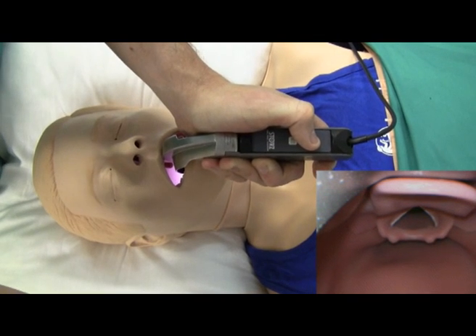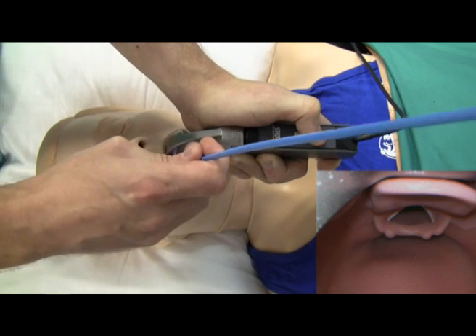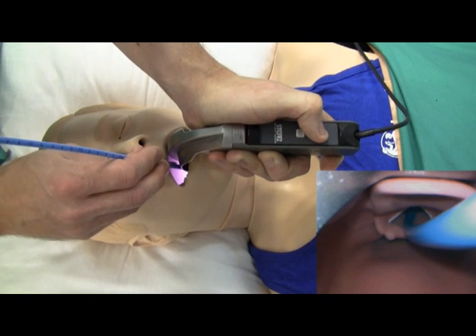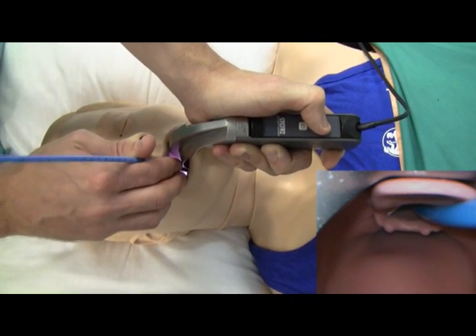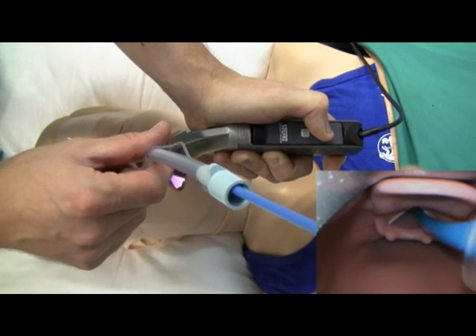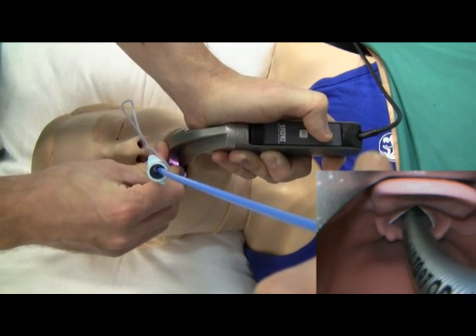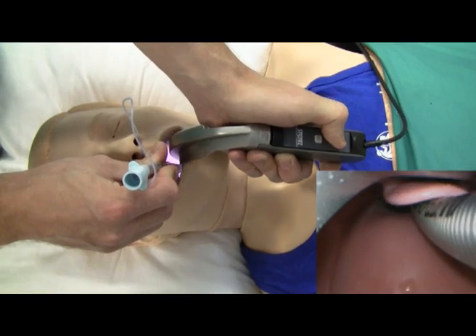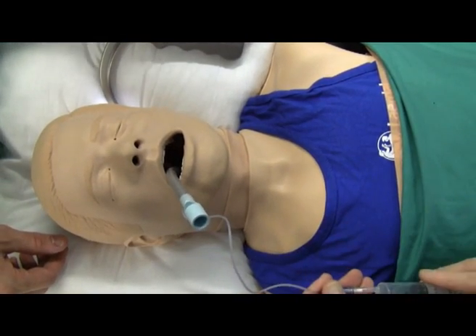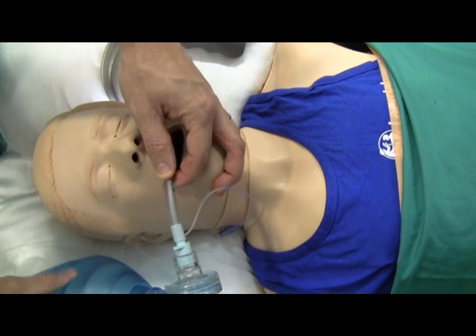Next, grab a bougie in your right hand and insert that into the mannequin's mouth — you'll see it come into view as the blue bougie. Advance that past the vocal cords and into the trachea. Ask your assistant to railroad the endotracheal tube over the bougie, making sure that you insert it beveled end first. Advance that past the vocal cords and down into the trachea. Remove the bougie, remove your laryngoscope blade, inflate your cuff, attach your ambu bag, and confirm that you can ventilate the mannequin's lungs.